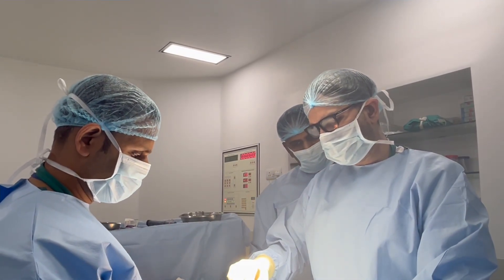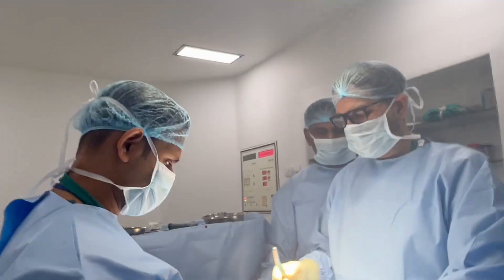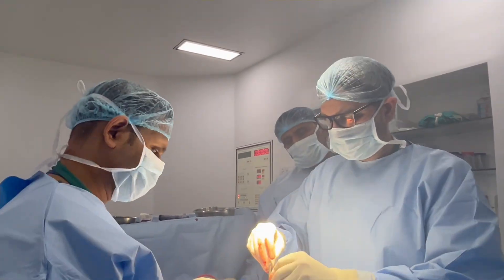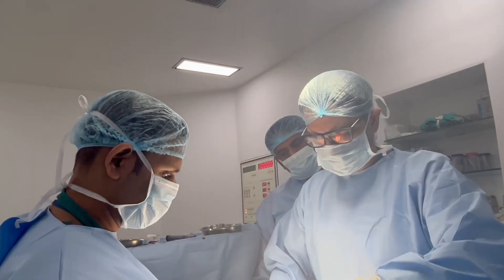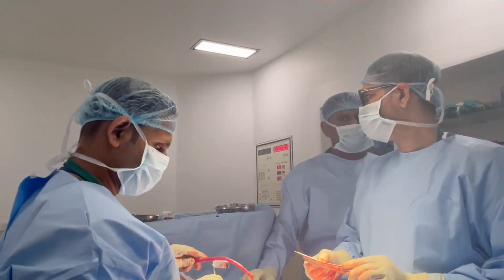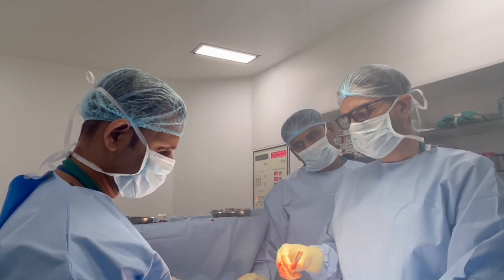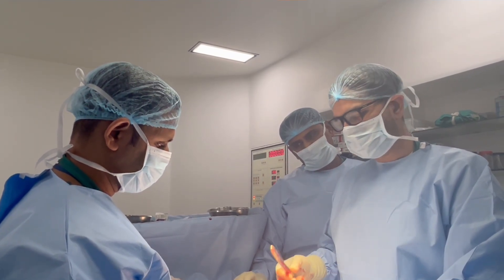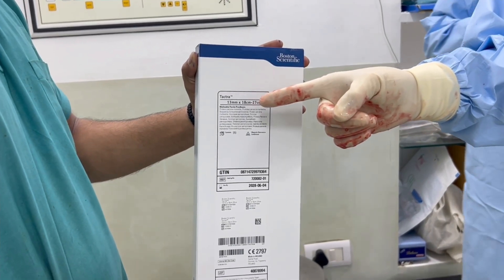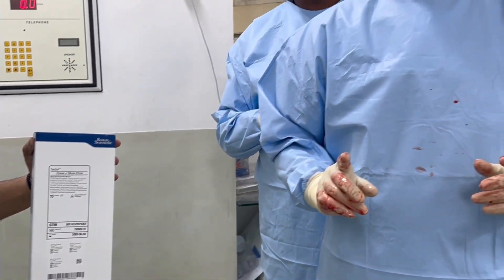Now we will open the other corpora with the blade. There are two corpora and we will place an implant on both sides. Now we will dilate from the dilator. The length is 22 cm and the diameter is 13 mm. So we will put two implants: 13 mm diameter and 22 cm length. You can see the size of the Tectra is 13 mm — the implant can be up to 27 cm long, but we have sized it at 22 cm.